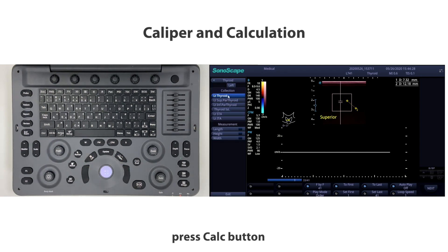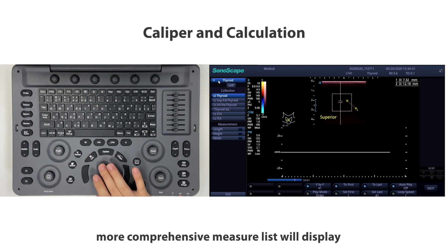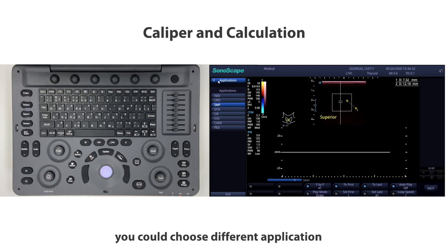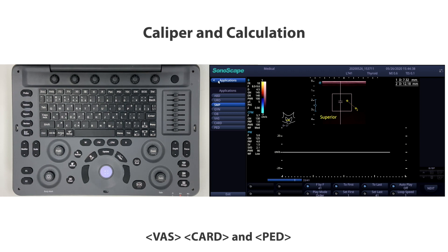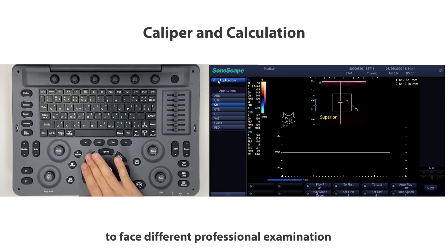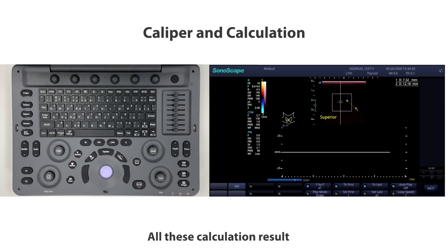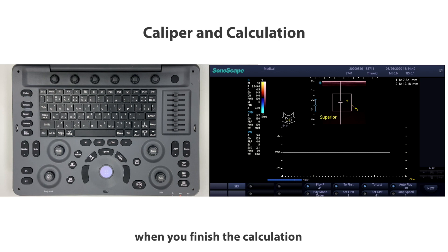If you want to go further with measurements, press the Calc button for a more comprehensive measurement list. You can choose different applications — we cover abdominal, urology, small parts, gynecology, obstetrics, vascular, cardiac, and pediatric to address different professional examinations. All calculation results will go to the report automatically when you finish.